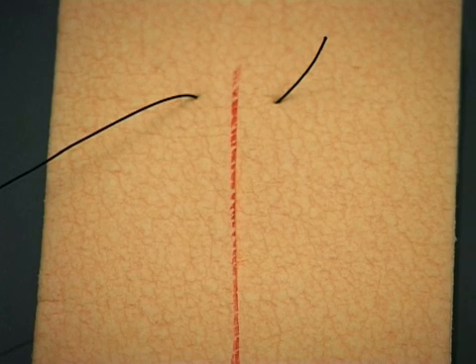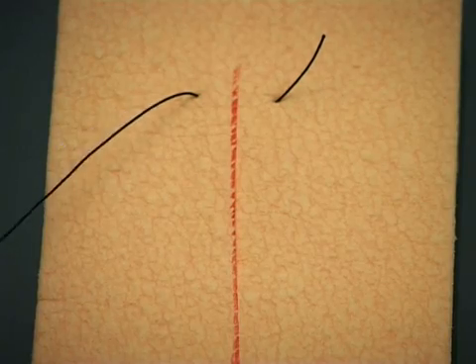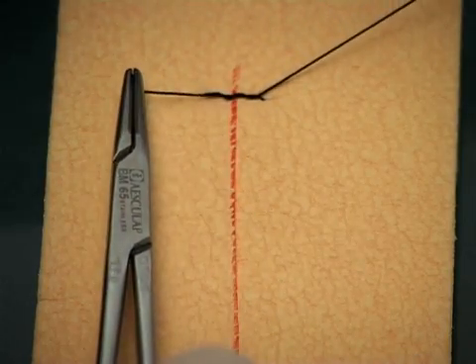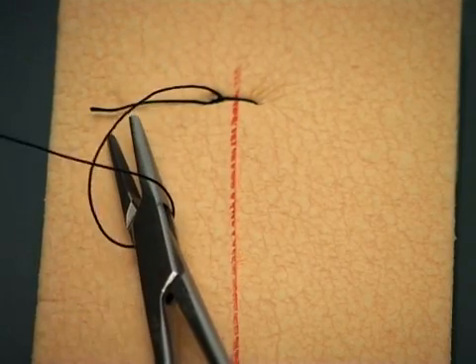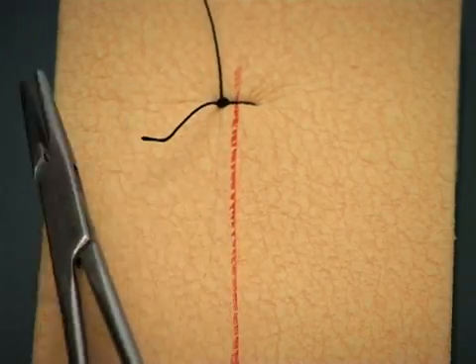leaving a convenient length at the tail end of the suture. This length will depend on whether you intend to use a hand tie or an instrument tie. Tie a knot to one side of the wound, rather than placing the knot directly over the wound. Take care to just approximate the wound edges and not strangle the tissues.